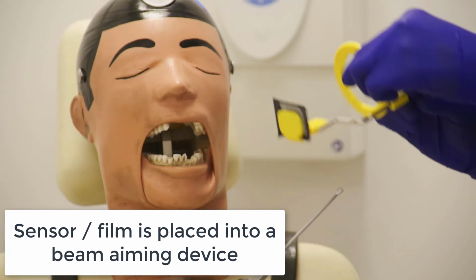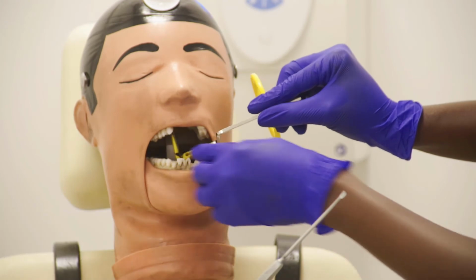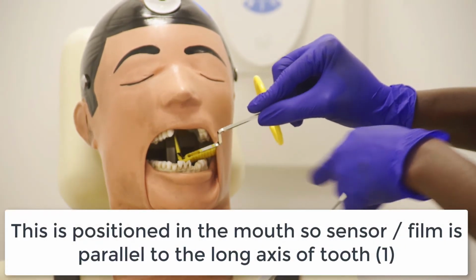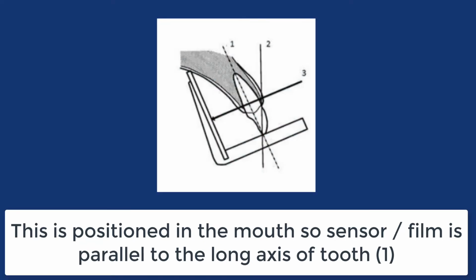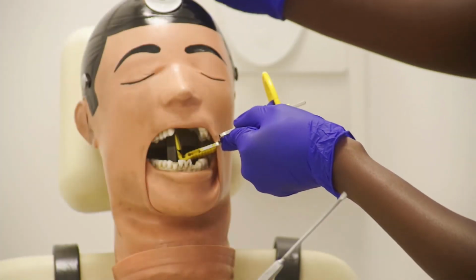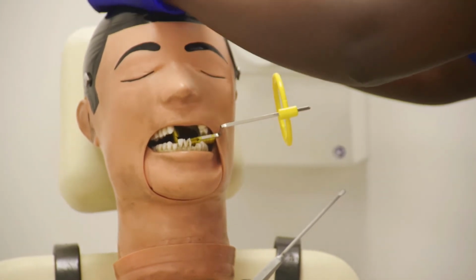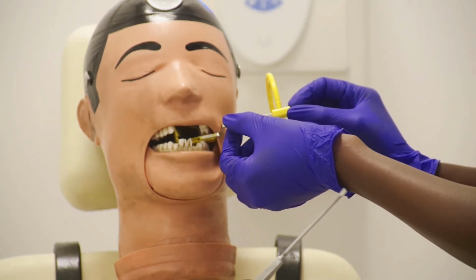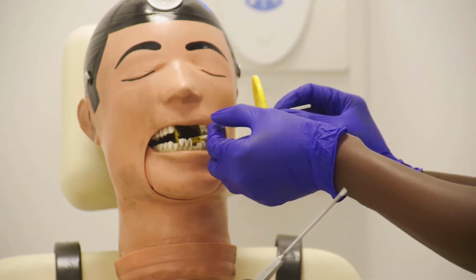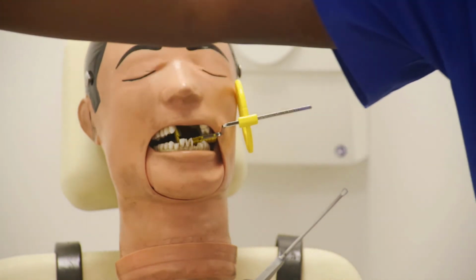Okay, and then I'll place the whole assembly in the mouth, making sure that the phosphor plate is parallel to the long axis of the teeth, as you can see here. Once I have it in position, I get the patient to bite down gently and then secure this in. Okay? Tell the patient not to move, keep absolutely still.